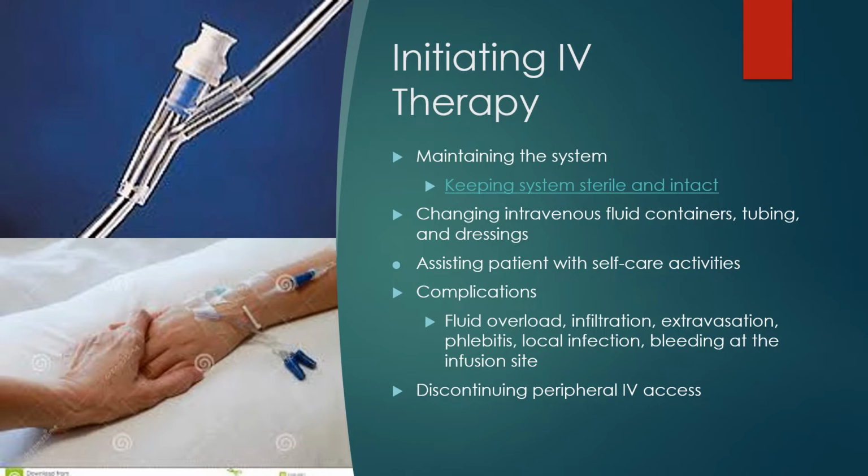Assisting your patient with their self-care activities, making sure we're still keeping that system closed, meaning there's no new bacteria able to enter, is ideal. So when your patient asks you to discontinue the fluids to take a shower, you need to tell them no and explain why it's not safe to keep disconnecting and reconnecting at that site.